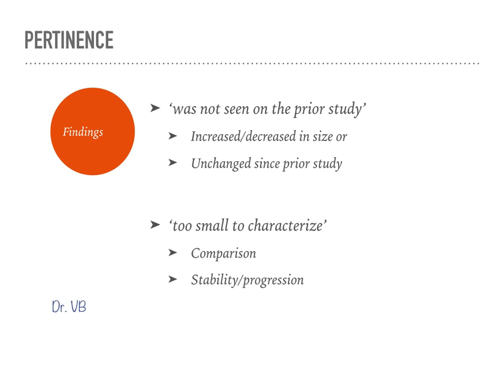"Too small to characterize" is a term we often encounter in reports. However, if using the modality which you are using, you are unable to characterize the lesion, availability of previous imaging, if any, might be able to give you an idea if the lesion is actually progressing in size or remaining static.